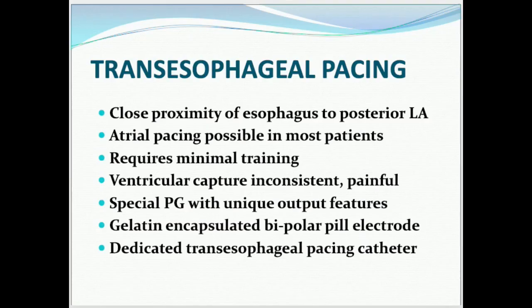However, ventricular capture is inconsistent and often painful, which seriously limits the therapeutic and emergency application of this technique. Transesophageal pacing is now used primarily to terminate supraventricular arrhythmias in patients under general anesthesia or in pediatric patients. It has also been used in pharmacological stress testing.